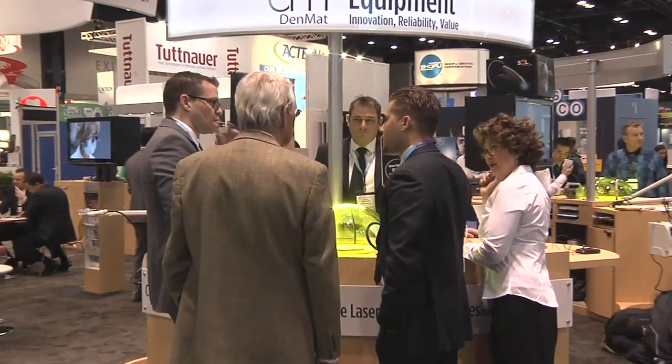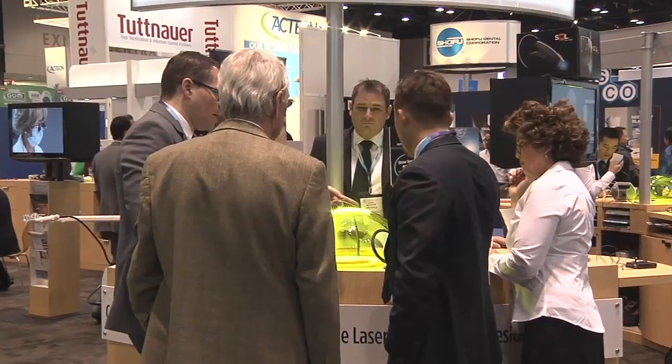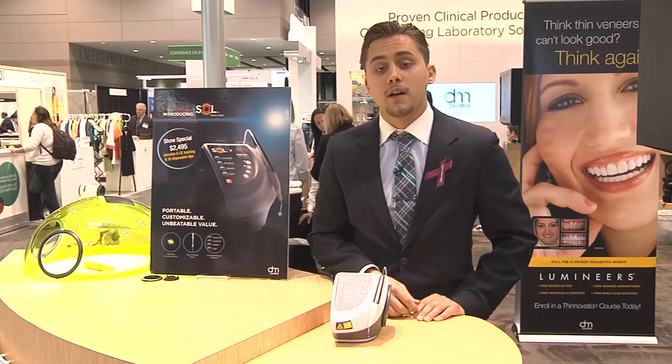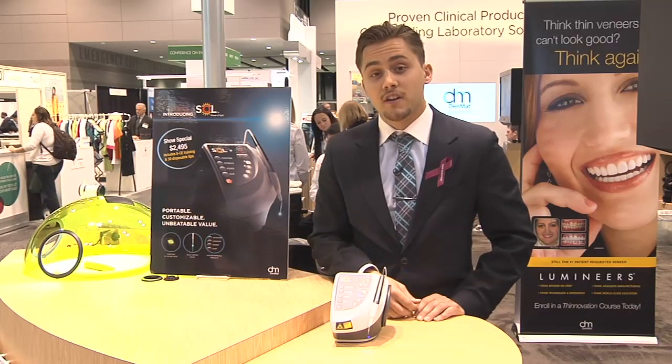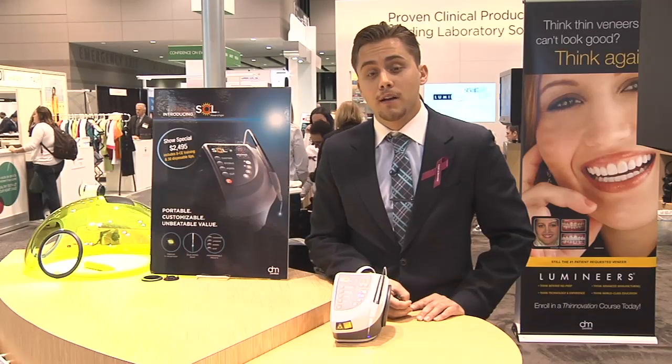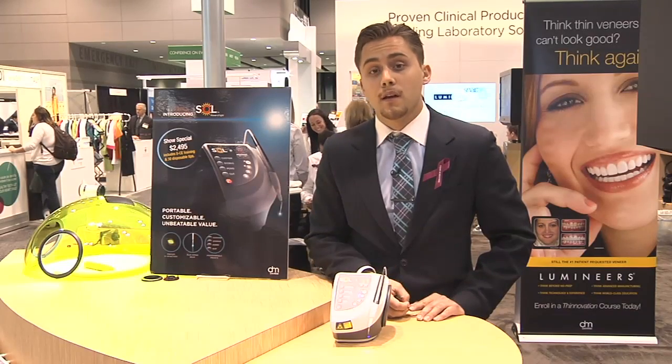When people come to the Denmat booth, they should ask about demonstrating the laser and understanding the true portability of it. We will show them how simple it is to integrate into their practice, how efficient it is at cutting tissue, and how this can all be done without needing to plug it into an outlet by simply working from the battery.